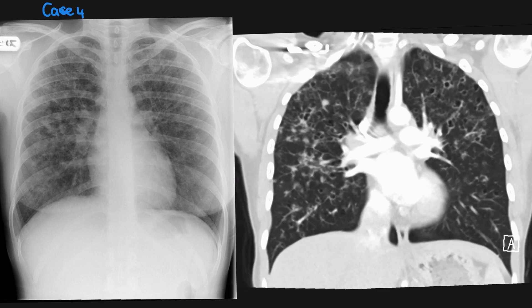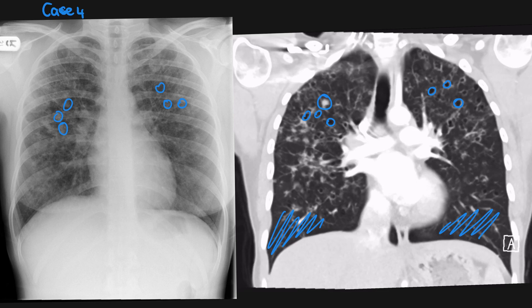The last patient is a 38-year-old lady who presents with a few weeks' history of cough and shortness of breath. Her chest x-ray is abnormal, with multiple nodular opacities seen in both lungs. On the CT, there are bilateral thin-walled cysts particularly in the upper lobes, and also some nodules. Importantly, there is again costophrenic angle sparing, and this is another case of LCH — I would expect this patient to be a heavy smoker.